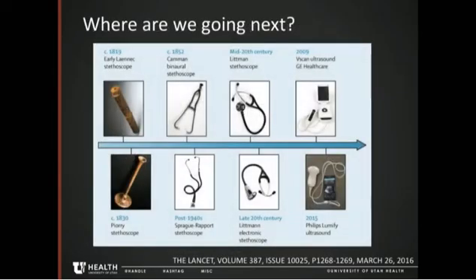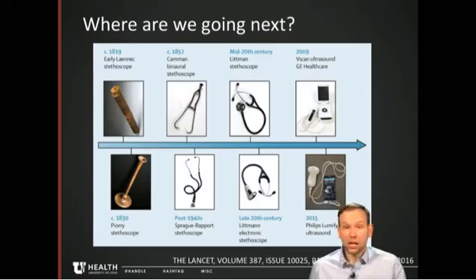A lot of people are thinking about the handheld ultrasound device as the next evolution of the stethoscope. And I don't really see why this won't be the case. We are looking at the lungs with greater resolution. Instead of listening to S1 and S2, we are seeing the heart moving. Instead of listening to breath sounds and crackles, we're seeing the density in the lungs. We're seeing the change in movement, the change at the pleural interface. I believe this is the future.